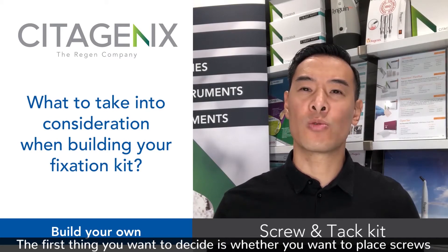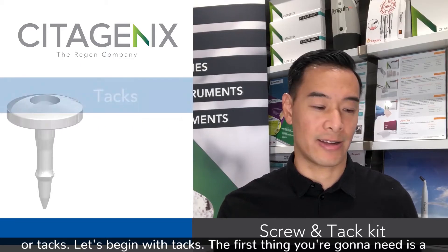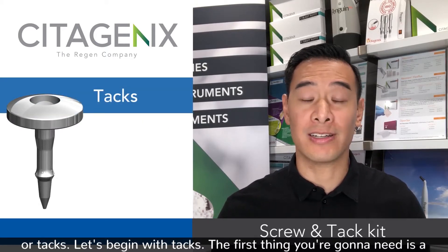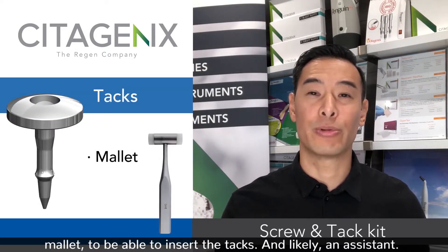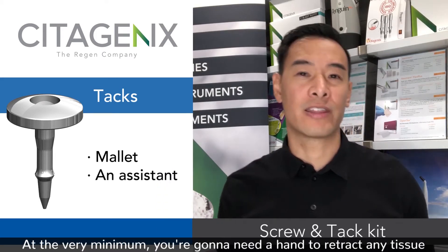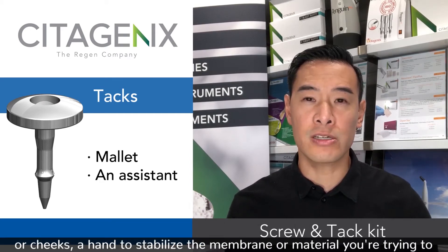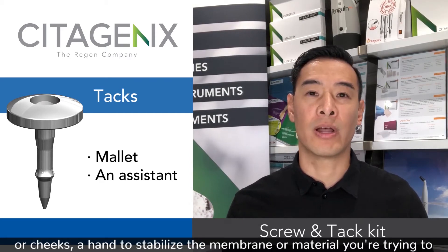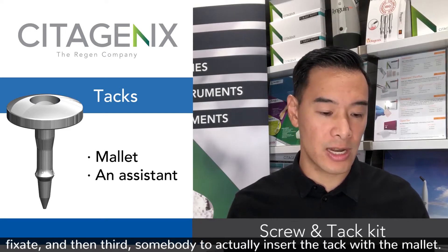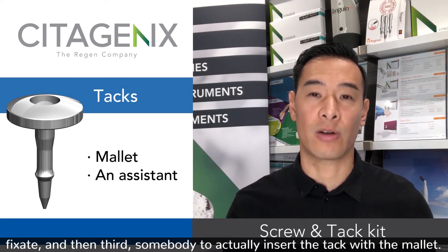The first thing you want to decide is whether you want to place screws or tacks. Let's begin with tacks. The first thing you're going to need is a mallet to be able to insert the tacks, and likely an assistant. At the very minimum you're going to need a hand to retract any tissue or cheeks, and a hand to stabilize the membrane or material you're trying to fixate.